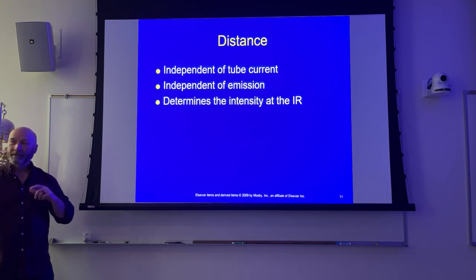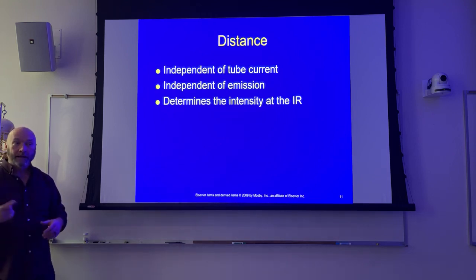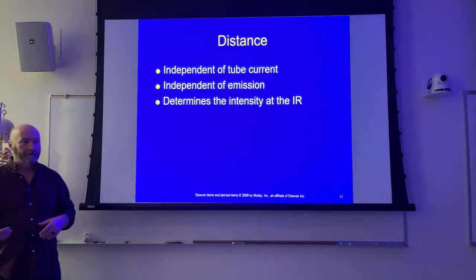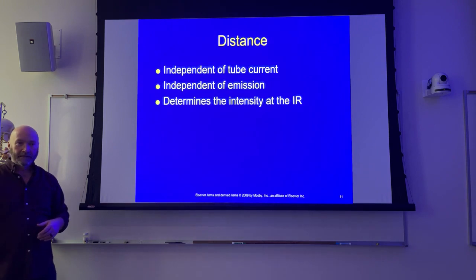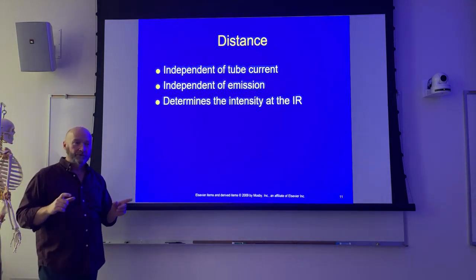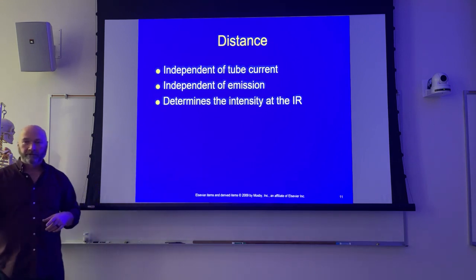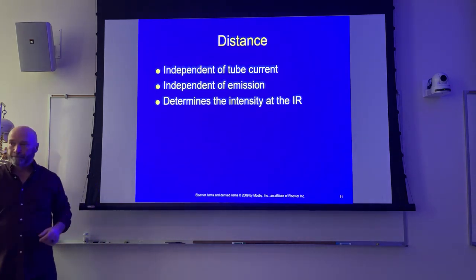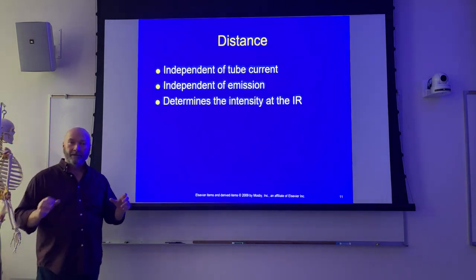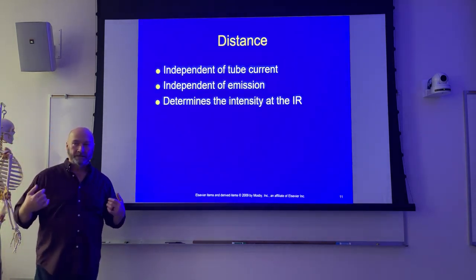Okay, I'll need to spend some time behind that control panel pushing buttons and seeing what happens, selecting different techniques, different exam types. Because every time you push a different exam type, it does a lot of stuff. It selects your focal spot size. It selects your photocells, which radiation detectors you're going to use. It selects your kV. It selects your mA. Sets backup time.